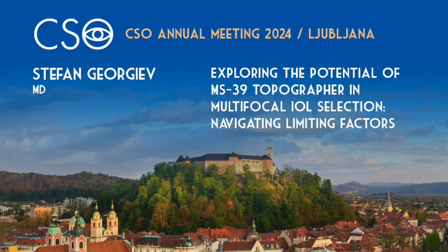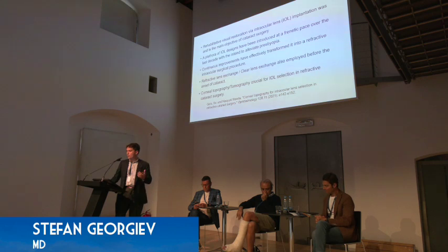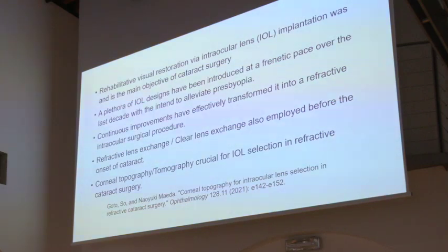I have the pleasure to talk about the potential of the MS-39 topographer in multifocal intraocular lens selection and its associated limiting factors. I come here from Vienna because, as we know, cataract surgery nowadays is no longer just a therapeutic procedure. It has effectively morphed into an intraocular refractive surgical procedure, mainly due to many improvements, but also due to the plethora of intraocular lens designs that are available nowadays to treat presbyopia.